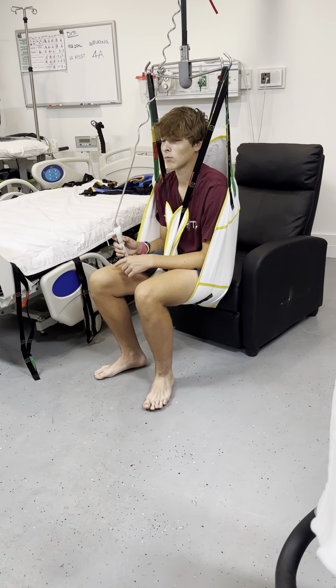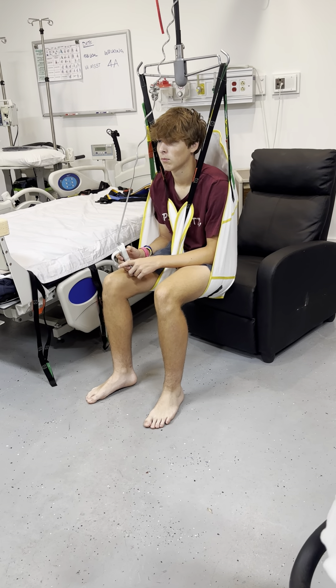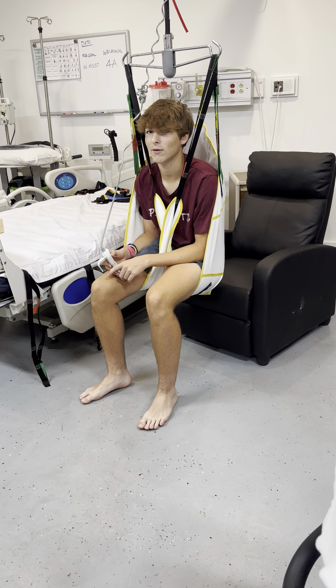Isn't that pretty comfortable? Get yourself into the chair. It's gonna be falling so much now.